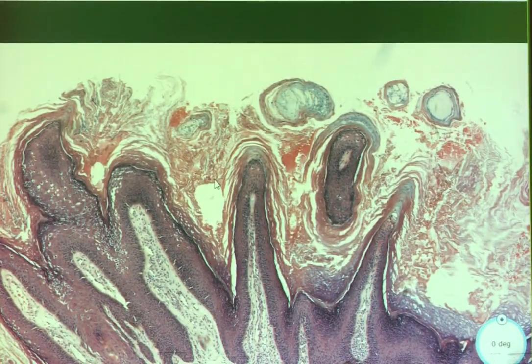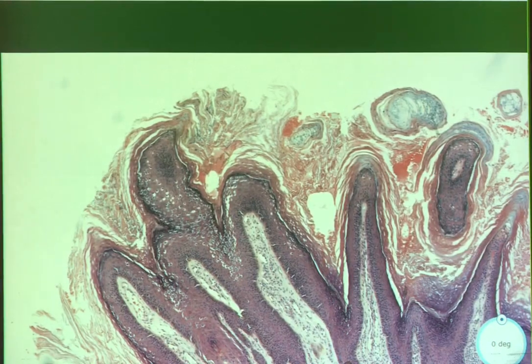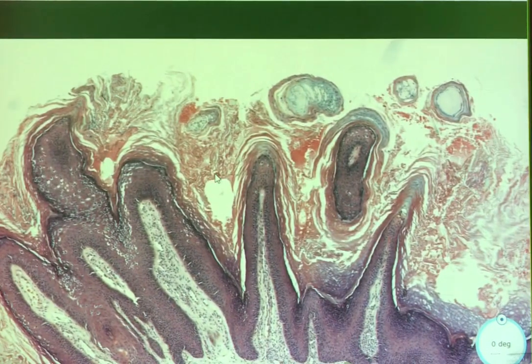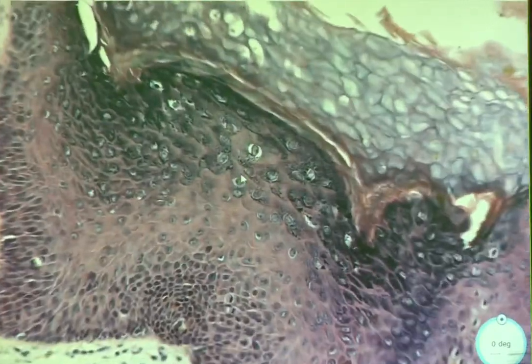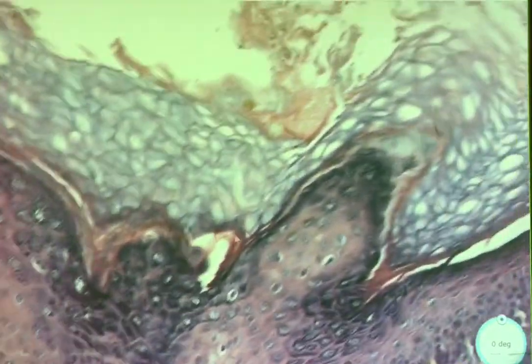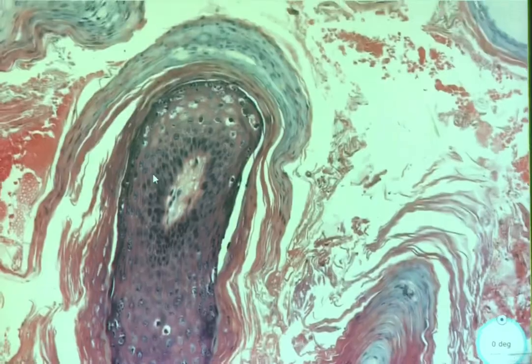And then there's even the keratins kind of on top of each other. I know there's a term for it, but I don't remember what the term is. Have like the steepling and stuff, where it kind of piles on top of these projections. And then the granular layer looks a little more prominent. I don't know if that's actually something we look for. That is something to look for. Okay. I do remember something vaguely.